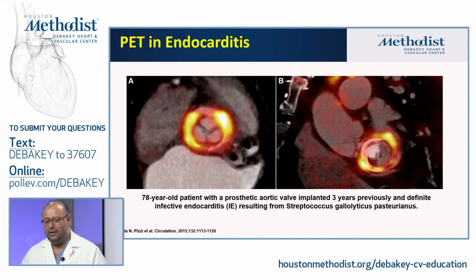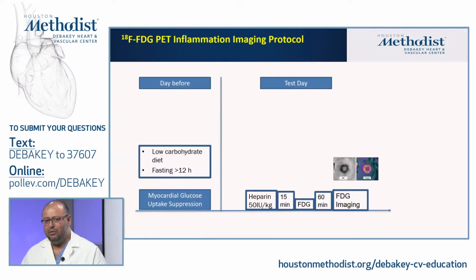of endocarditis, we need to prepare the patients very well, because what we do is that we are giving them fluorodeoxyglucose, and when we give them fluorodeoxyglucose, the myocardium likes that too. So we have to prepare the patient in a way that the myocardium doesn't take that fluorodeoxyglucose, and it will leave it for all these white blood cells and bacteria that are in the area of infection.